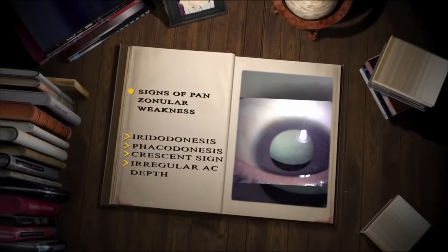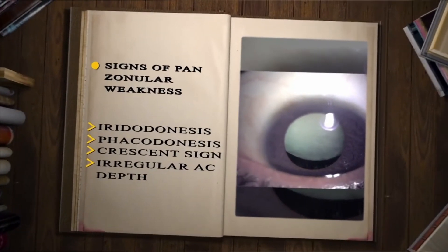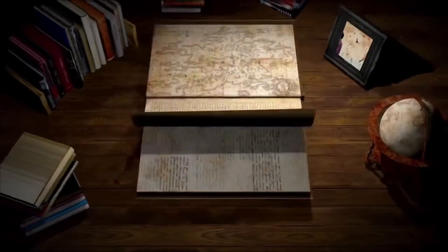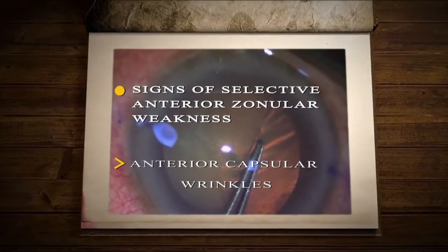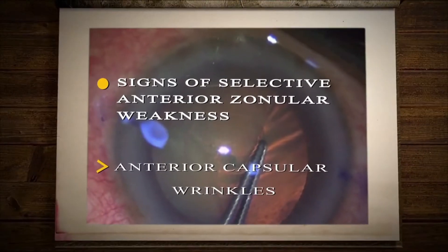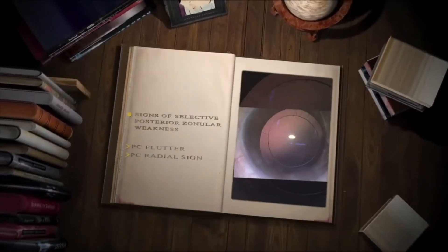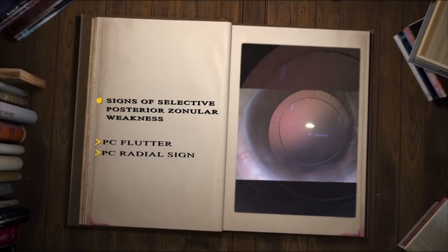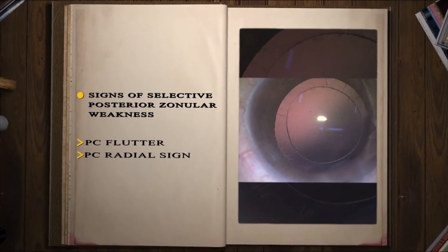The signs of pan-zonular weakness are well described in literature. The present video aims to demonstrate and discuss the signs of selective anterior zonular weakness, namely the capsular wrinkles, and selective posterior zonular weakness, namely the capsular flutter and the PC radial sign, and their management.